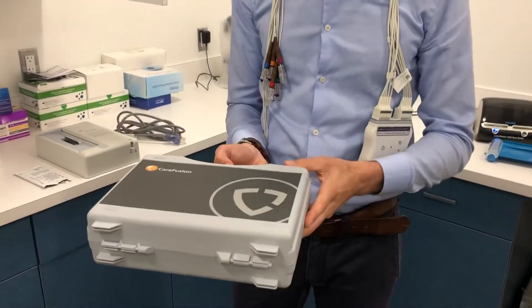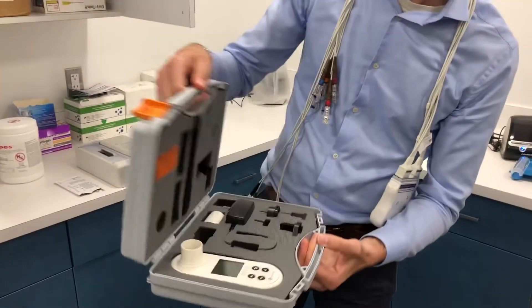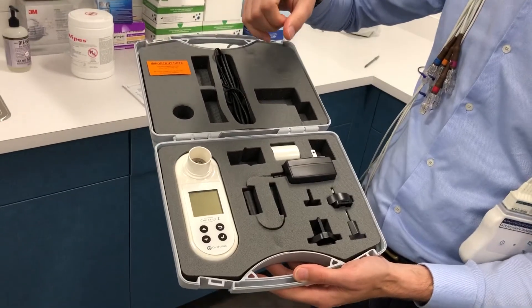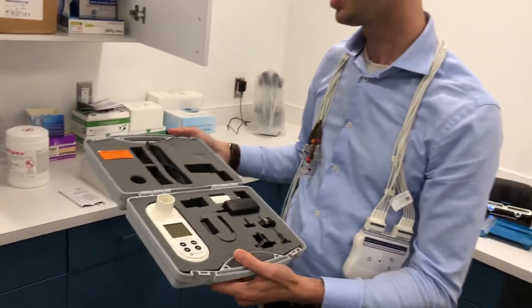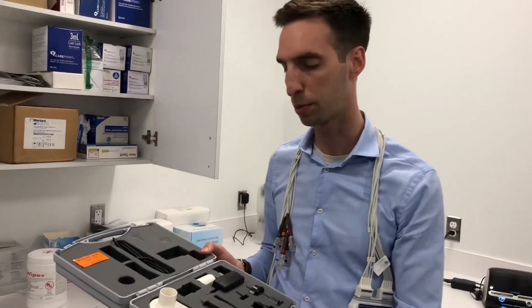For the spirometer, we use the CareFusion Micro One. It will just display the FVC and your basic readout for a pulmonary function test. It's really easy to use for our patients and really comfortable for them.